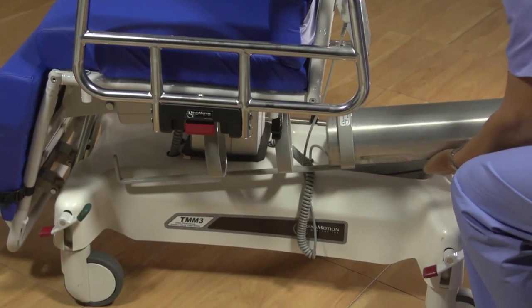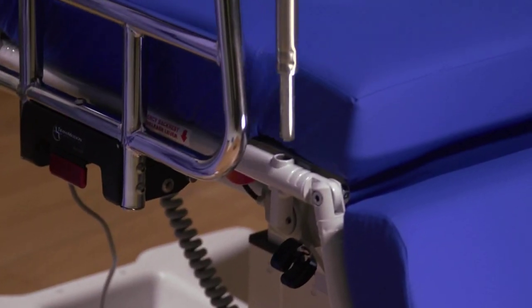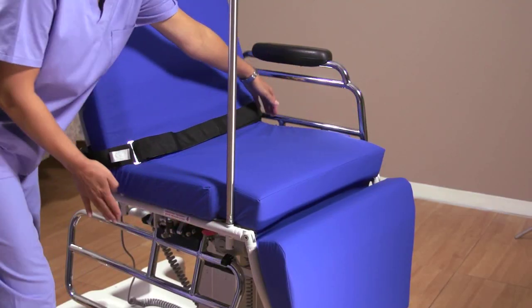Your chair might also have accessories like an oxygen tank holder mounted on the chair and an IV pole, which can mount in any of the four wells located at the corners of the seat section.